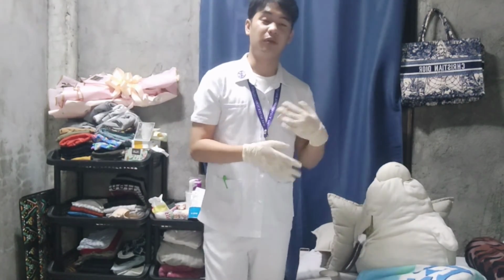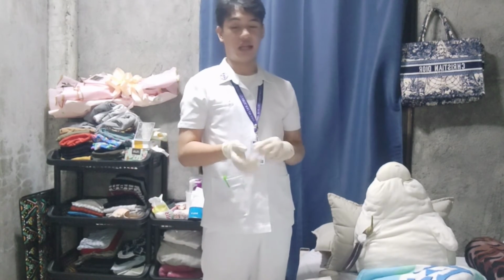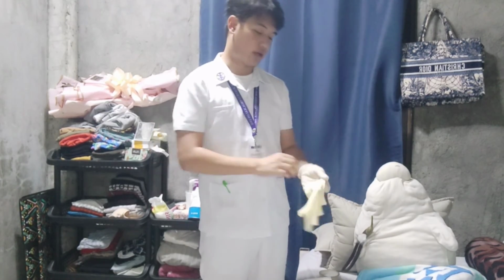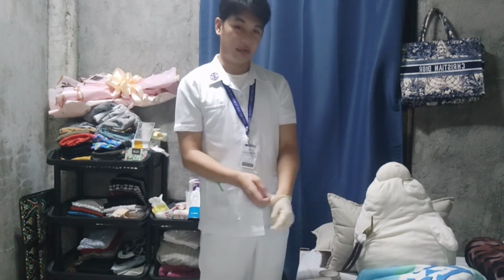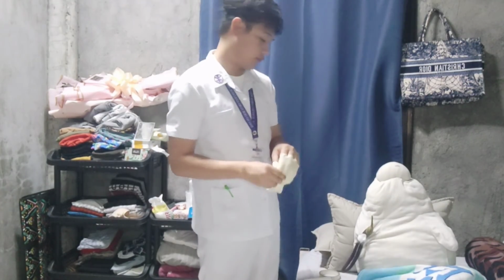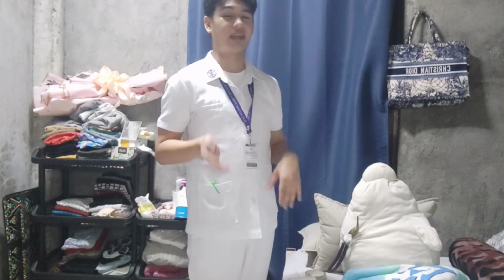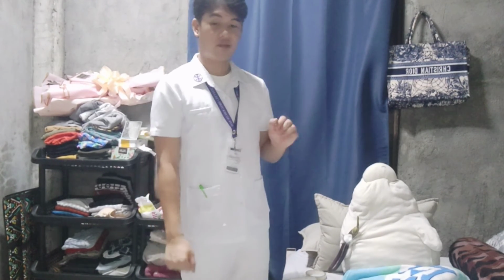Doing this helps to deter the spread of microorganisms. We need to do the aftercare as well. We need to document after removing the gloves and performing hand hygiene again. We need to document all relevant information: the time of administration, the drug name, the dose, the route, and the client's reactions to the medication. This is to secure the record and enhance proper endorsement.